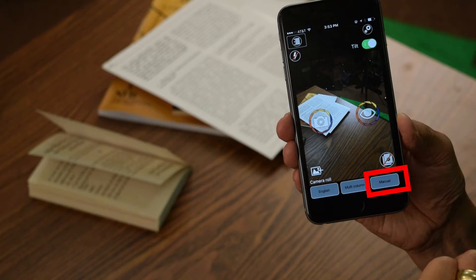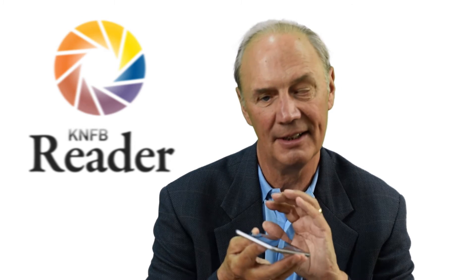To change how a picture is taken, we have to change what the reader refers to as the profile. You'll find the profile button in the lower right-hand corner of the screen, down to the right of the home button on your iOS device. Select profile — it's the furthest one over.